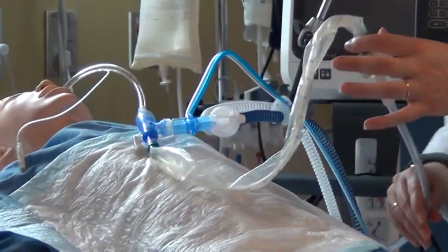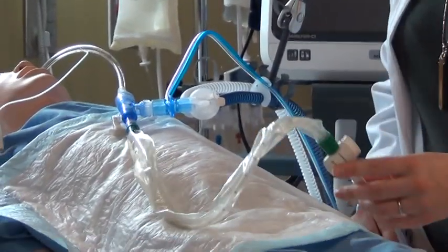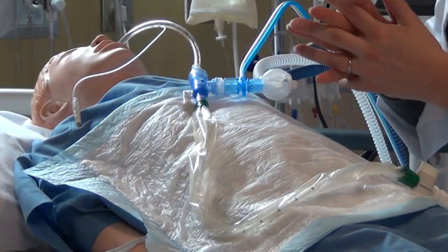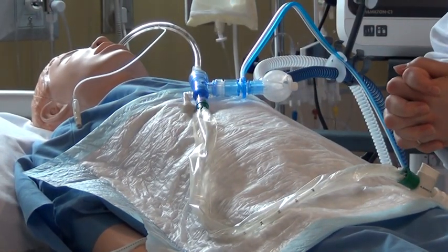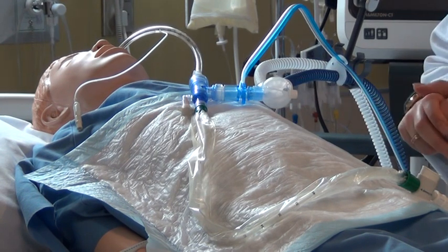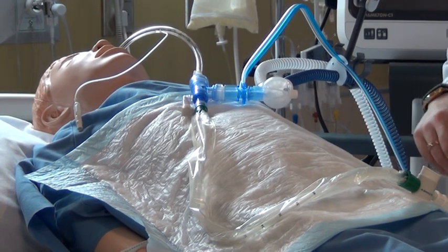So this is called an inline suction, so you may see this in some settings, or as I said, it might not be there and you would have to use your own suction catheters in order to suction our patients. So this is a role of both the nurse and the respiratory therapist that would do this type of work.